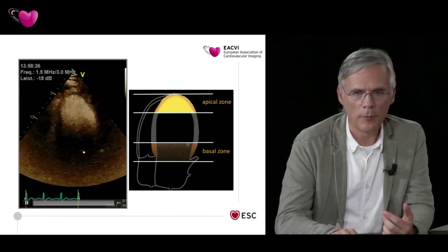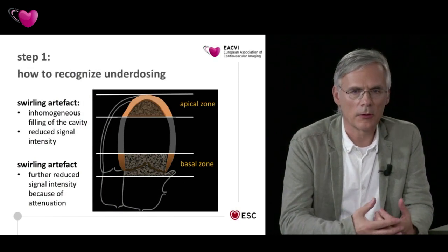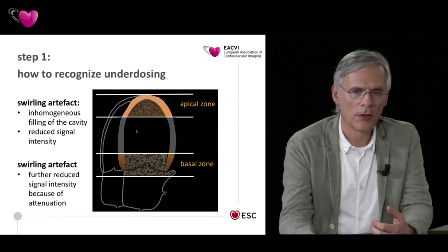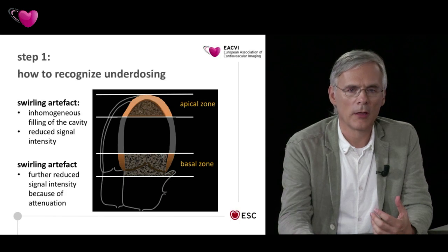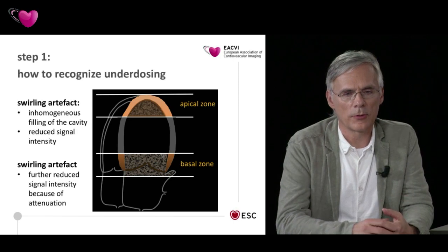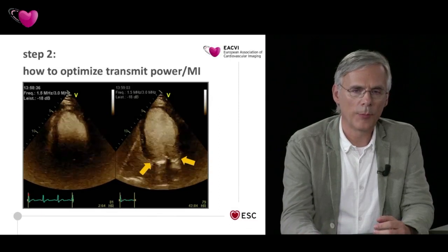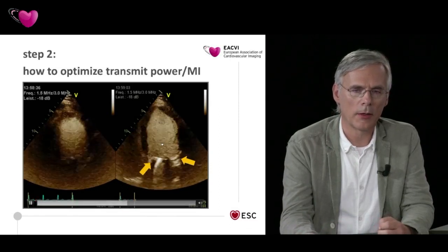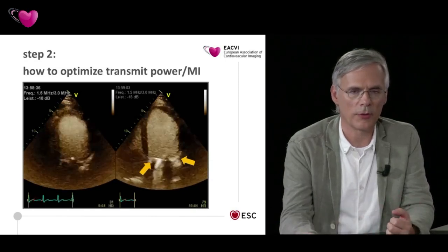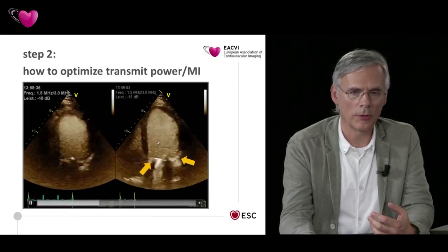If we wait a few minutes, there will be a dilution of the contrast agent, and there will be a kind of underdosing. It will be difficult to define the border again. The cavity is inhomogeneously contrasted by the contrast agent, and we have a reduced signal intensity. So in this patient, I recorded the images about 30 seconds after the contrast agent filled the cavity, and I think the contrast concentration is good in this patient.